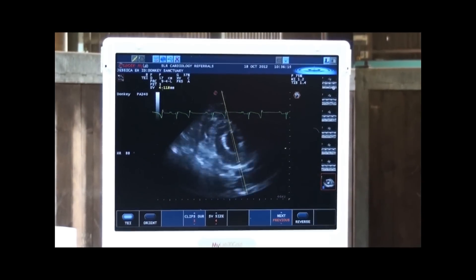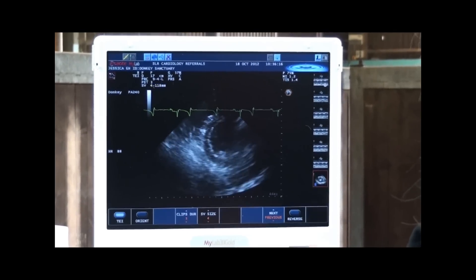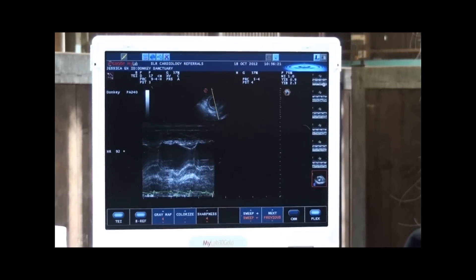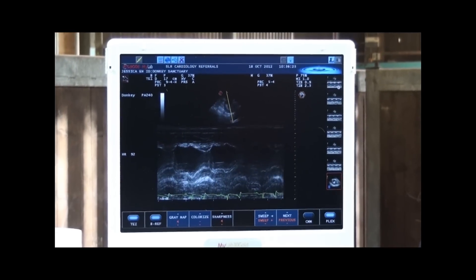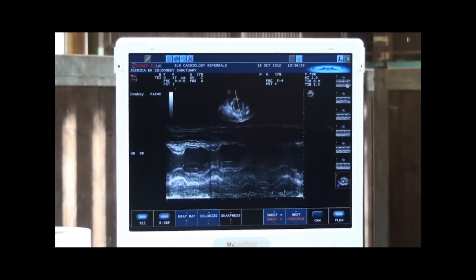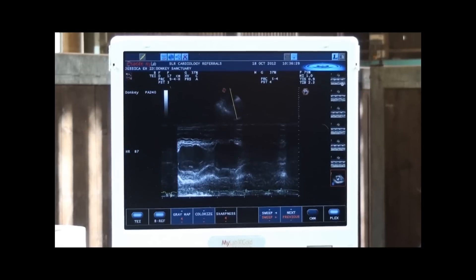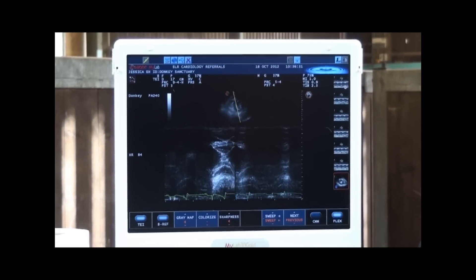In order to take measurements we use a different type of image called an M-mode, and this allows us to take measurements so that we can see how big the main pumping chamber is when the heart's beating and when it's relaxing.